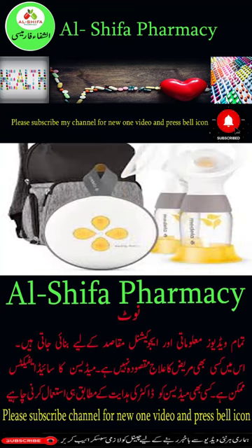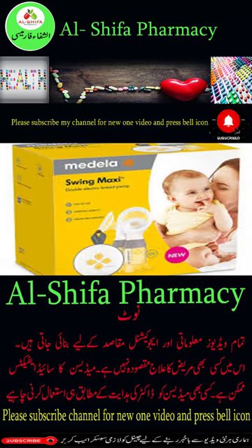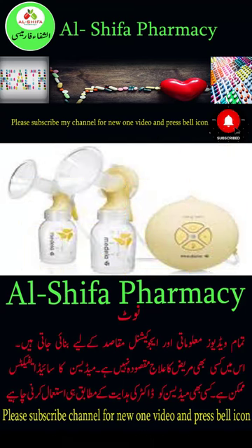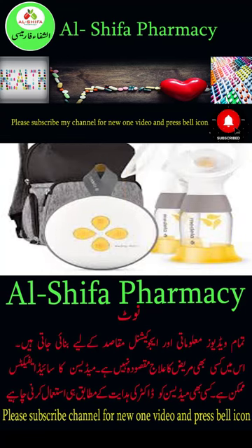The Medela Swing Maxi Double Electric Breast Pump offers double pumping with 18% more milk in lesser time. It mimics the natural sucking rhythm of the baby, providing increased comfort for the mommy. It comes with improved mobility that runs on a built-in rechargeable battery for up to 6 pumping sessions.